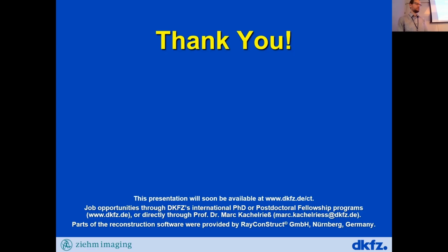I have just a question. It's trained on simulated data and it works on phantom data, but still, do you have any idea of what is a favorable situation and what is a challenging situation for this to work? I think a big challenge is noise in the projections. If you, for example, have a lateral projection in the abdomen, then you could have very high noise, and the DeepTool extraction can be unable to extract the tools.